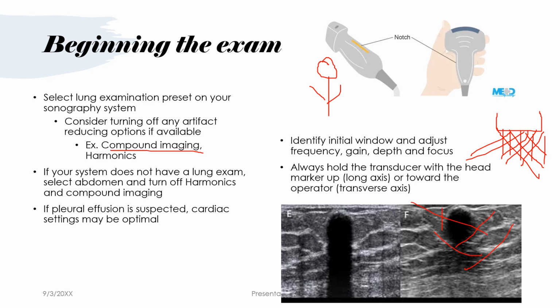So here's an example where compound imaging is used, and it's gathering information straight down, from the side, from the other side, and straight down. You see posterior to this attenuating mass, it provides really good information. And so it gets rid of a lot of artifacts.